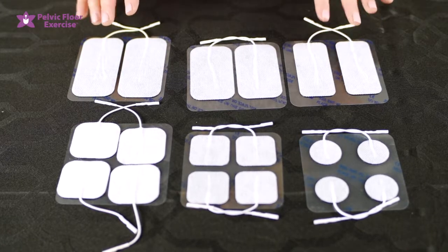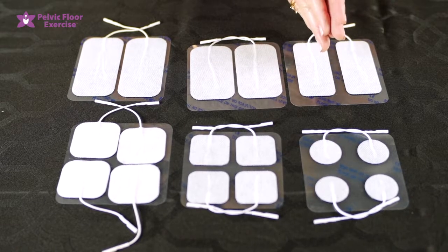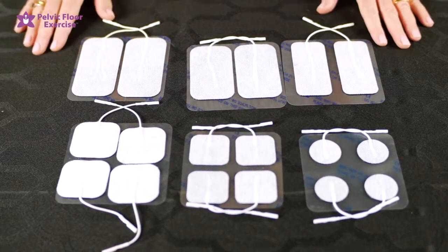You just need to make sure that your electrodes are not too close together when you use them on the body. There should be at least the width of the electrode between each of the electrodes, otherwise the current can just cross between them rather than penetrating to the skin.